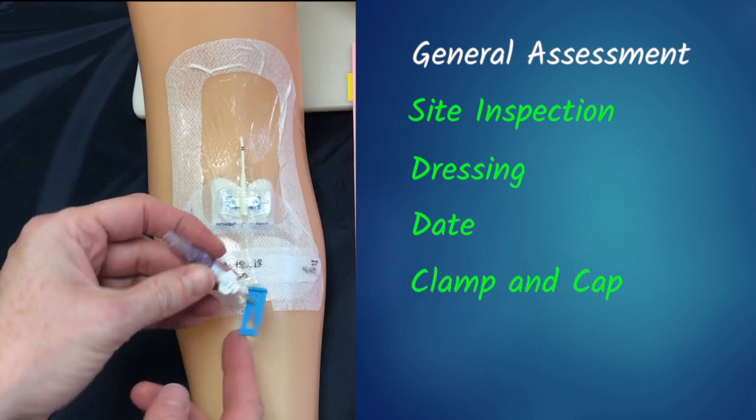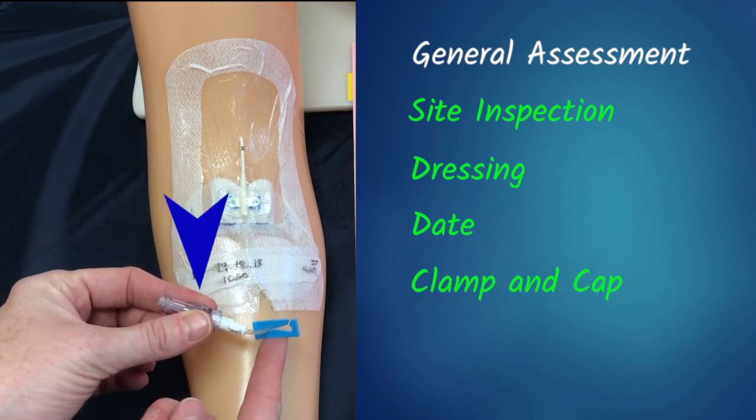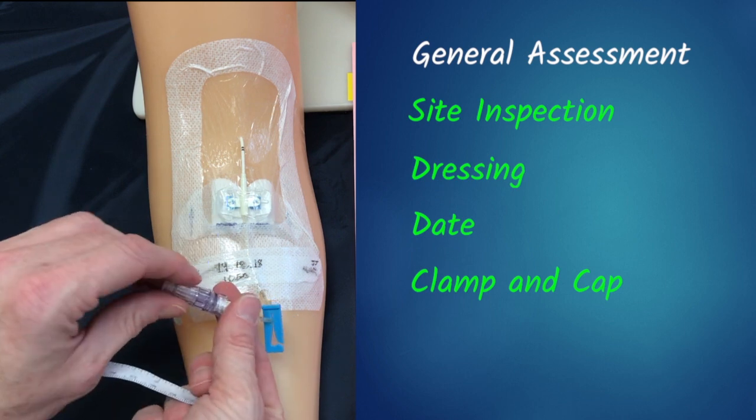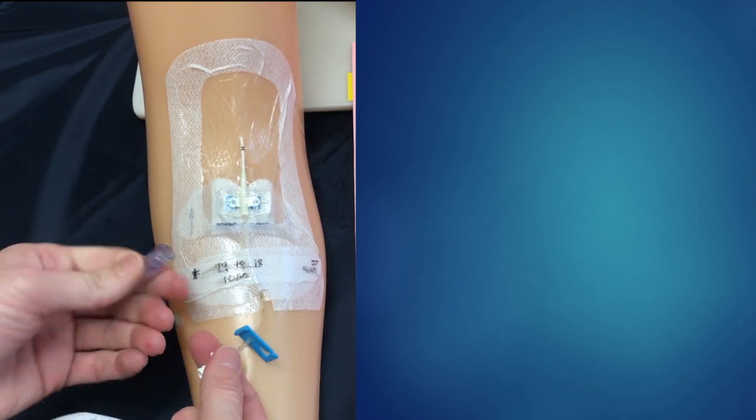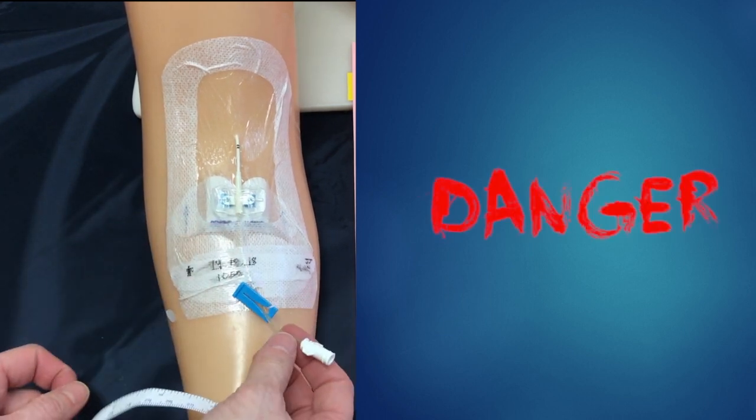Moving on to the clamp — we want to make sure that it is locked if not in use, and that we have a neutral connector on our tip. If for some reason our neutral connector were to come off and our lock was not secure, our patient would exsanguinate.